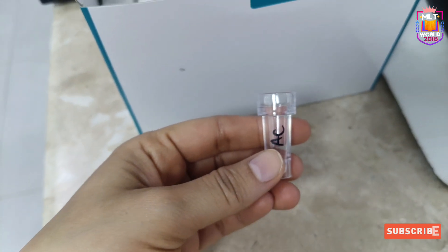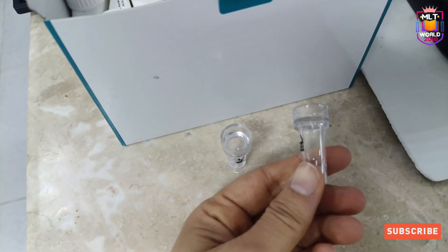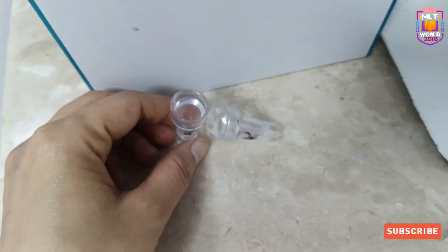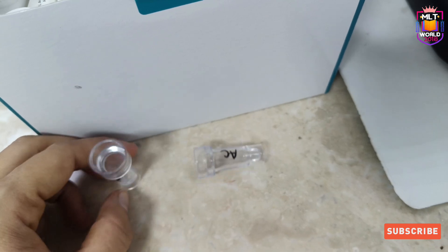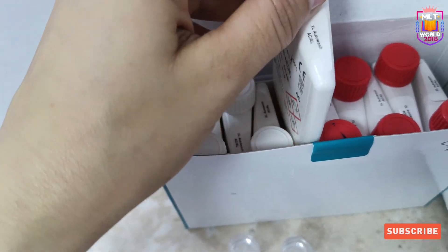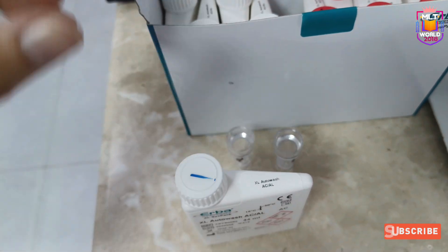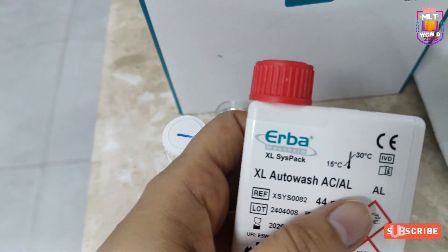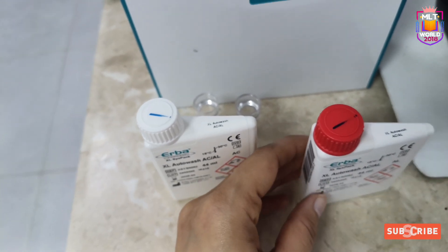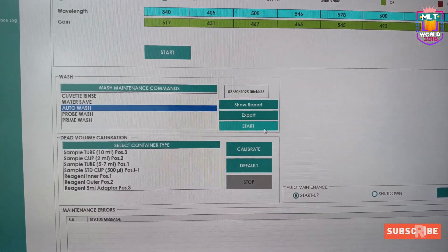We also need two Hitachi cups because we need 200 microlitres of each solution. You can label the Hitachi cups AC and AL. You can wash them and reuse them. This is the AC reagent with a white cap, and this is the AL auto wash reagent with a red cap. Mark the date of opening so you know which reagent is currently in use.